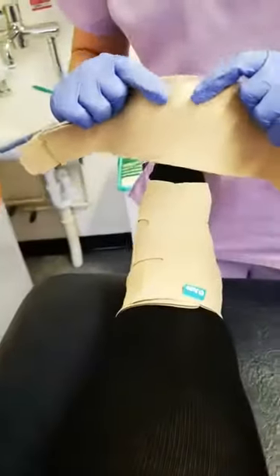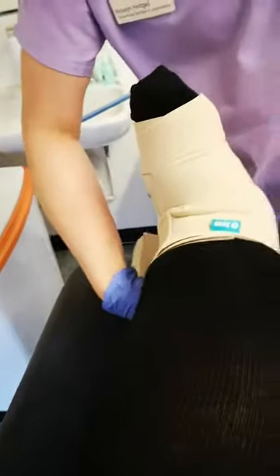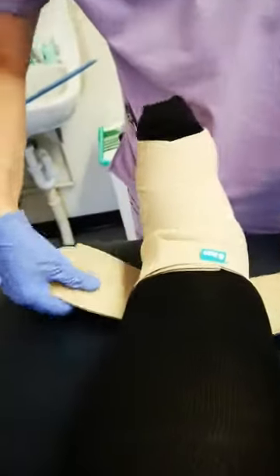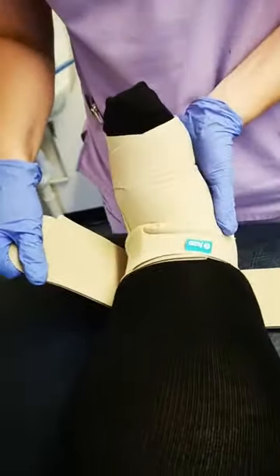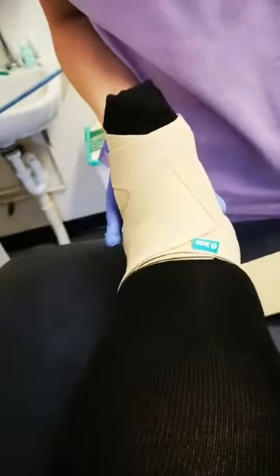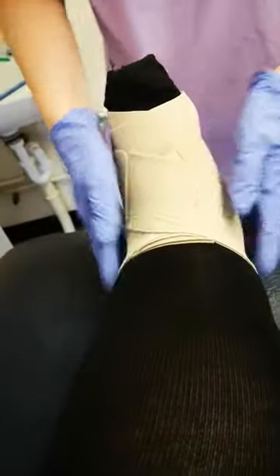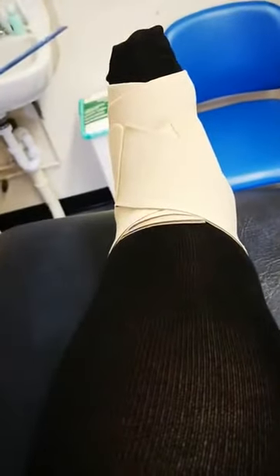You've got a bit of velcro and that attaches to the back of this, which will give more compression around the ankle. I'm pulling and crossing around the ankle — that really holds the ankle in. Now I'm going to get the leg mat and strap it on the ankle.